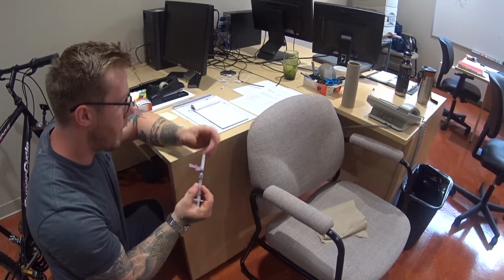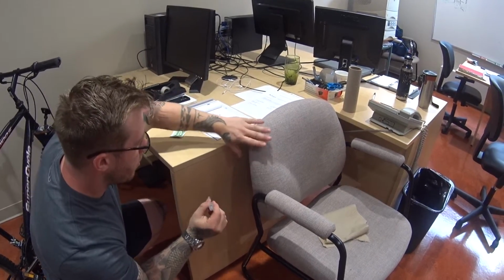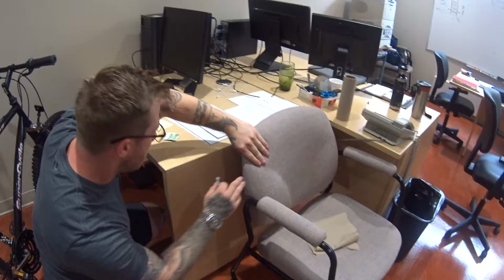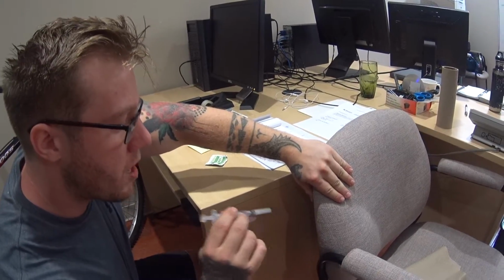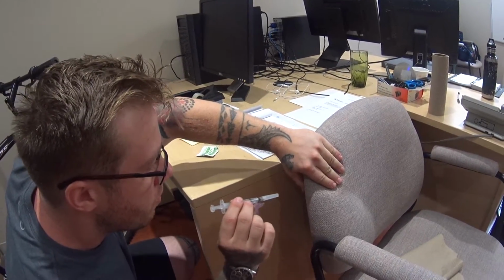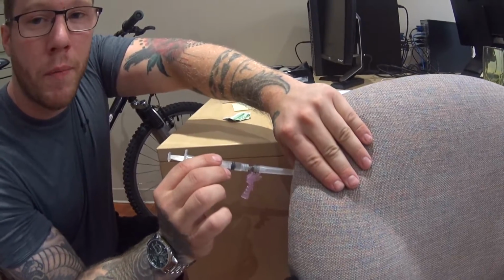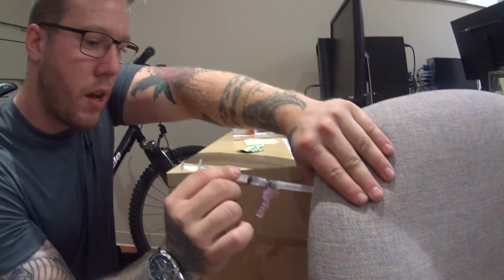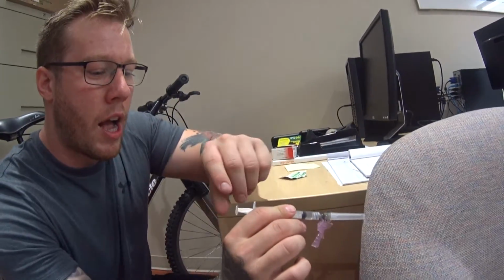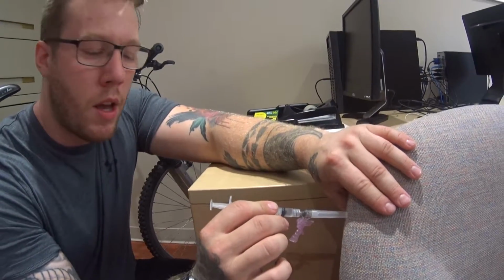I'll take the cap off my needle, though for testing purposes I'm just going to leave that on. I'll go in, Z-track, take the alcohol swab away, and ask Joe Milton to relax. I'll count down from 3, 2, 1, and inject the needle at a 90-degree angle. Once the needle is inserted into Mr. Milton's delt, I'll go ahead and aspirate the needle. At this point we're looking for flashback of blood.